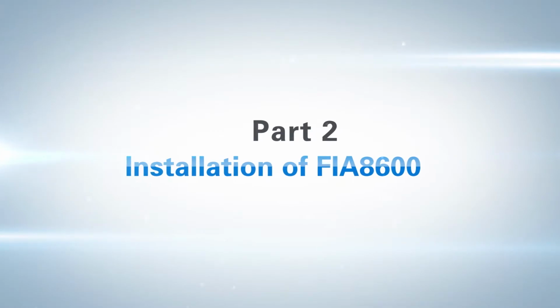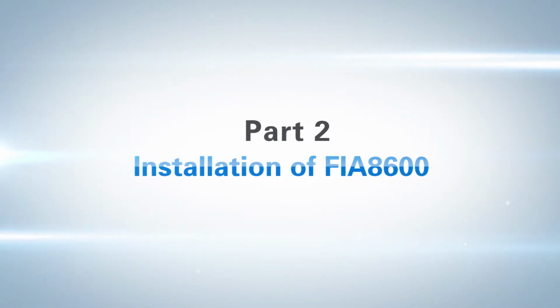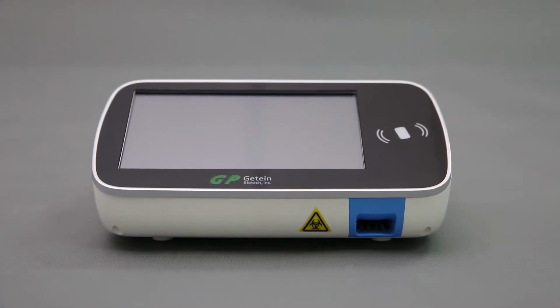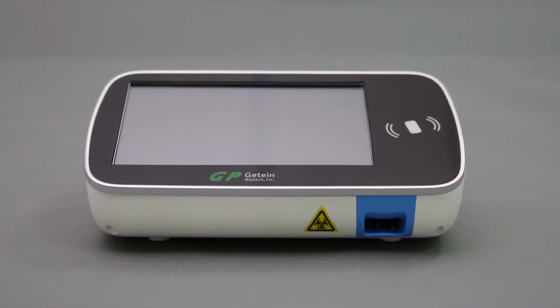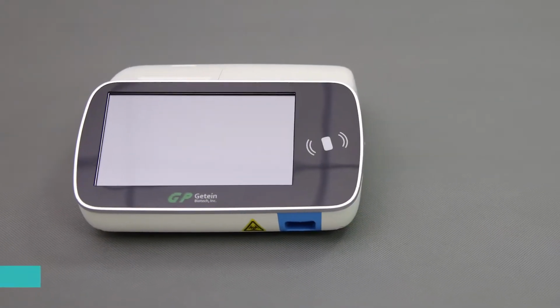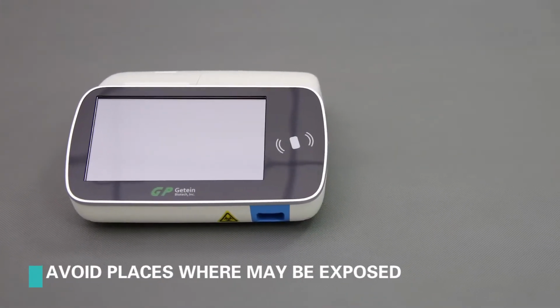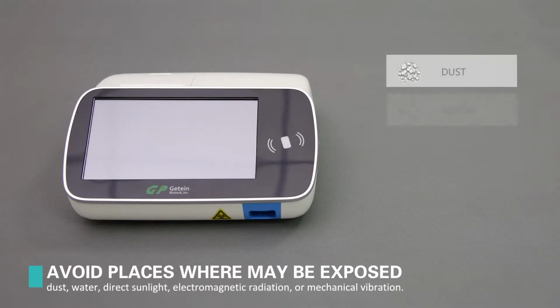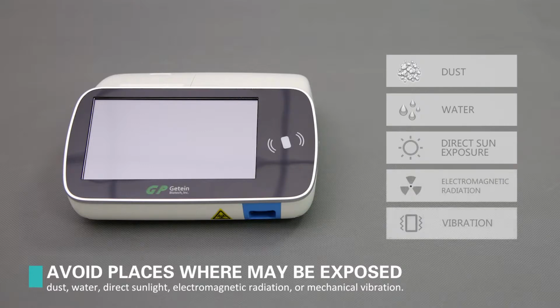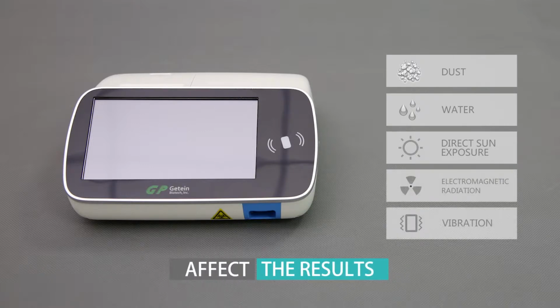Part 2. Installation of FIA8600. The FIA8600 analyzer should be placed horizontally on a clean table with enough space for performing tests. Avoid places where it may be exposed to dust, water, direct sun exposure, electromagnetic radiation, or vibration, as these factors may affect the results.